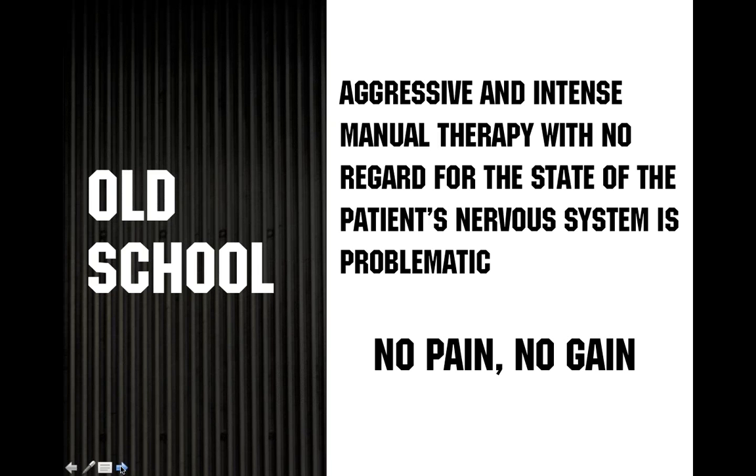Again, many of our patients and clients crave this type of technique, and they feel this is the way they're going to get their output. And on this whole no pain, no gain idea, I think we can revert and look at something more along the lines of graded exposure. Graded exposure is a term that Lorimer Moseley and Butler use within the biopsychosocial research to actually change behavior. We think we can use it for changing behavior with regard to the tools.